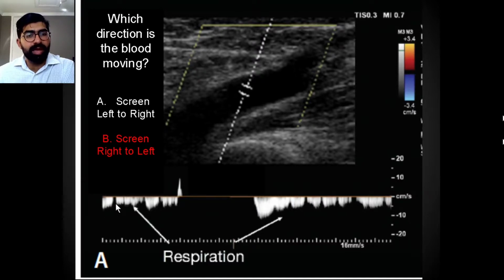Now, as you look at the Doppler waveform, you see that most of the blood flow is in fact negative, especially in the velocities. So you can deduce that yes, in fact, if the settings were adjusted a little bit better, you would indeed see blue coloration in this vessel. And so this is, again, really, really important to know. And you always have to look at the other things that are present on these images to get a better understanding of how to read the venous physiology.